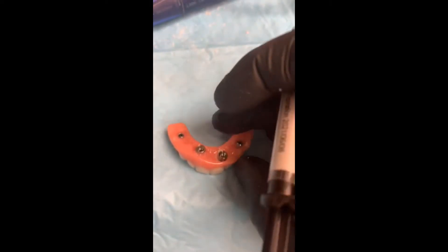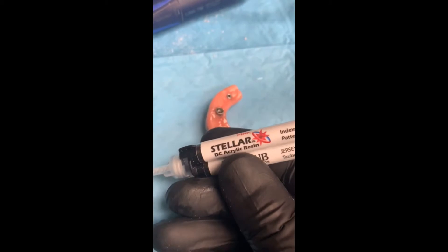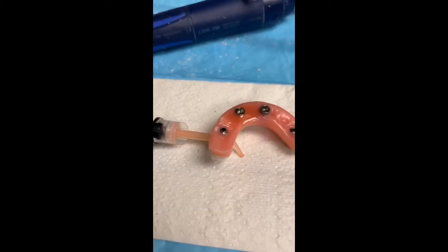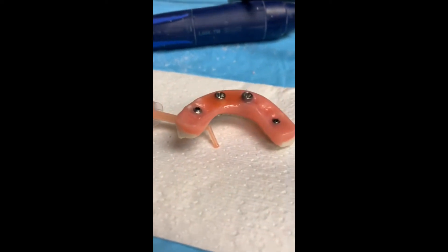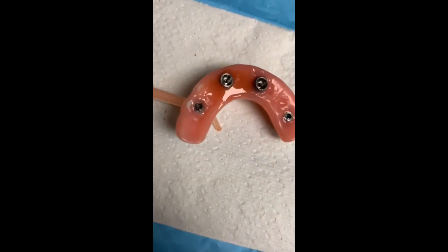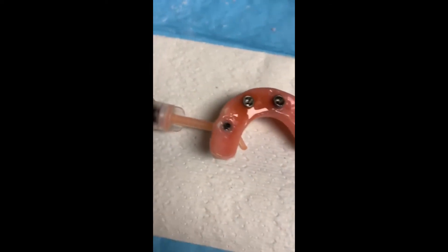I do need to add a little bit of pressure under the tissue, so I'm going to be using the Stellar Pink to accomplish this. You can see how that Stellar material flows very nicely into the cavities to make it a very nice, cleansable and hygienic area, so that you don't even see the white pinking through the pink.